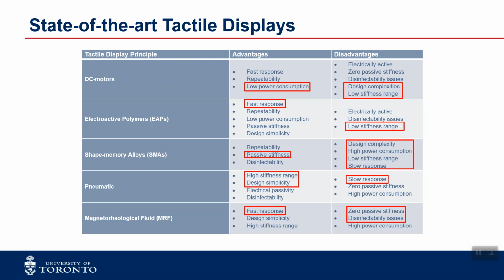We did a great job by reviewing the literature and finding advantages and disadvantages of all the available tactile display principles. The properties that are outlined are the advantages and disadvantages that are not marginal.